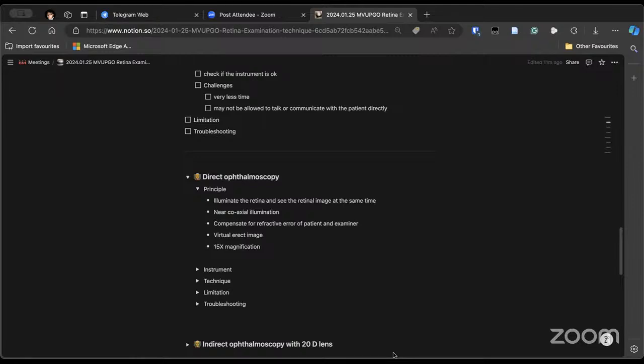If the patient is normal, the reflexes are equal. If there is a dull reflex on one side, then it indicates that there is some media opacity or cataract or something like that. Or if there is an increased reflex on one side, it could be due to a squint. And there might be anisometropia also. It might give you a clue of this.